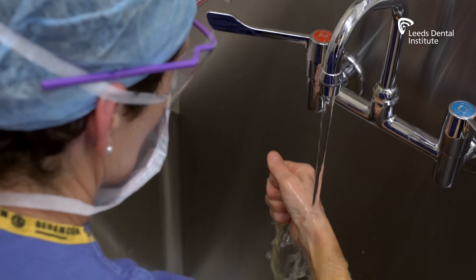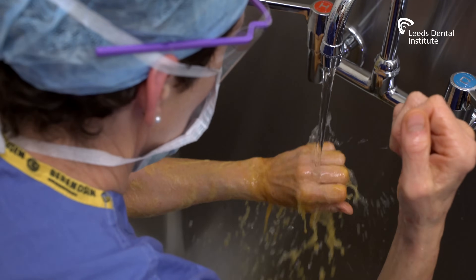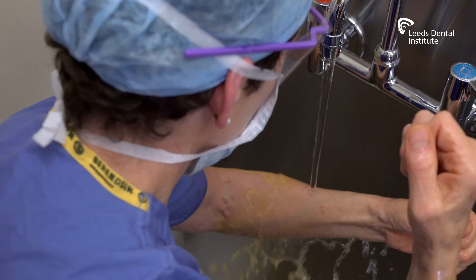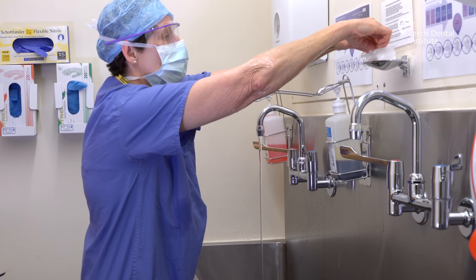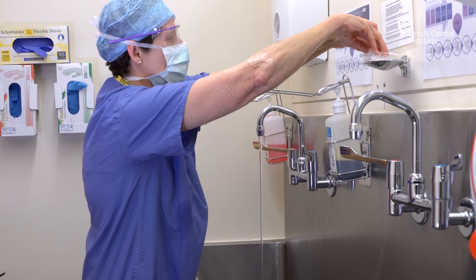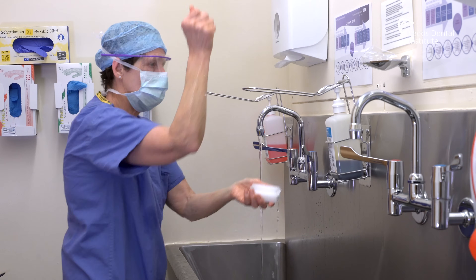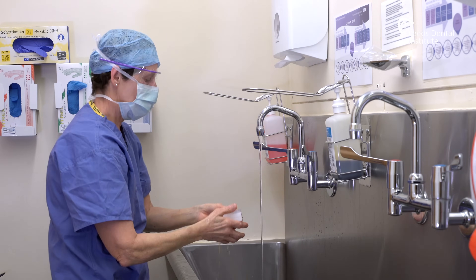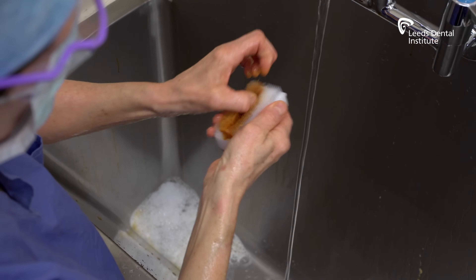Rinse your hands and arms from the fingertips to the elbows, allowing the water to flow to remove the scrub solution. Pick the scrub brush up, wet and apply 5ml of solution to the brush side and use to scrub your nails only for 30 seconds per hand.